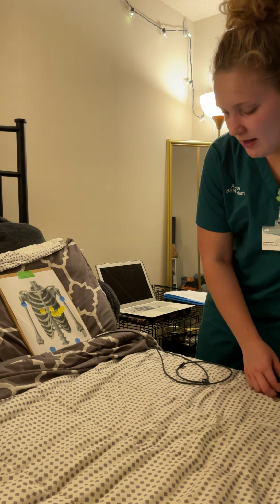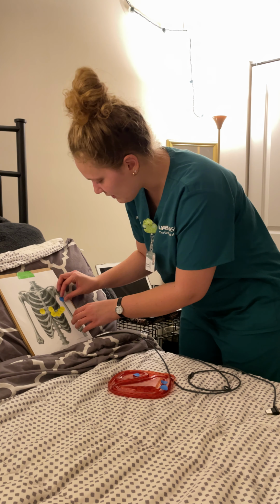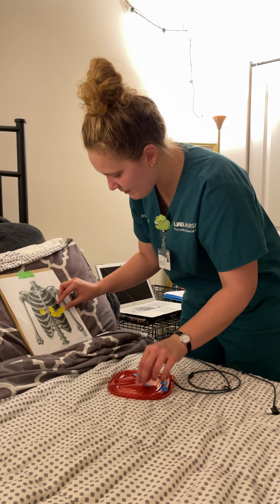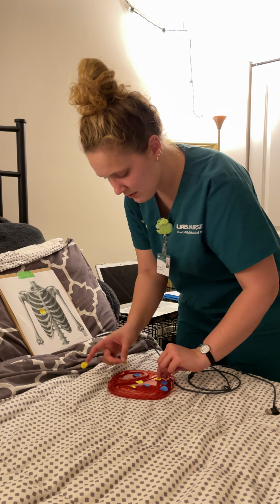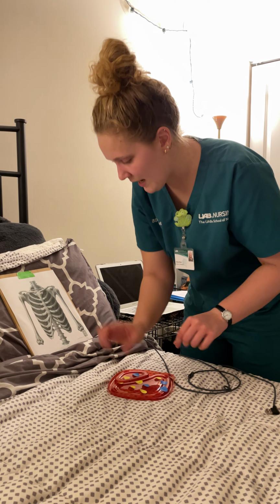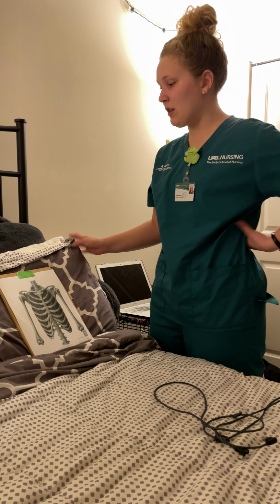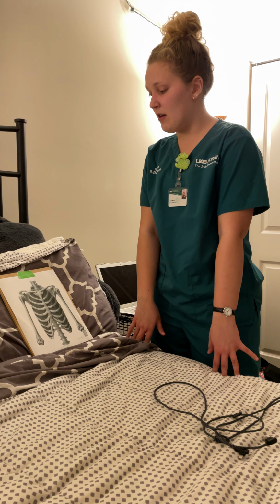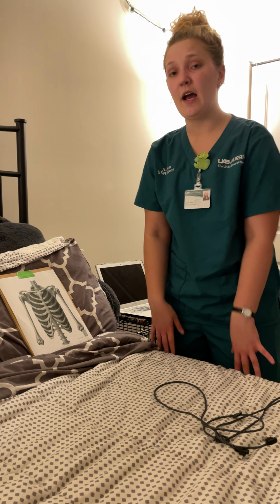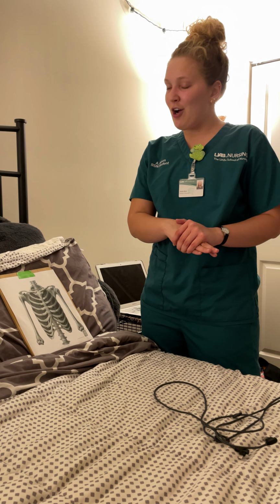After this, I'm just going to take all of the stickers off. I would cover you back up, Miss Gee. And if you would like the head of the bed raised, again, a pillow back underneath you, I would lower the bed to the fully lowered and locked position. I would put the handrail back up, make sure that your call light is within reach.